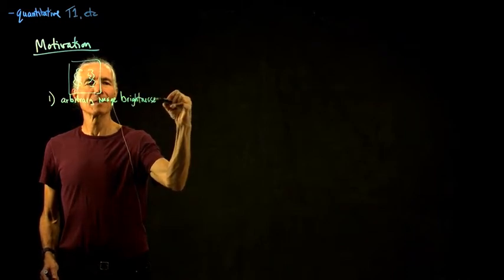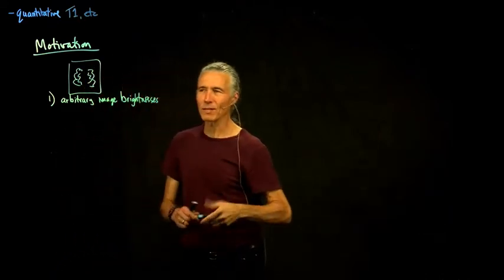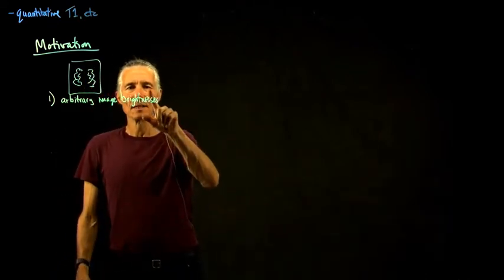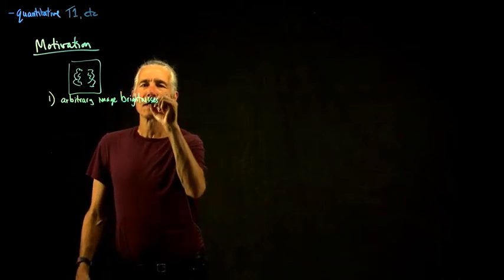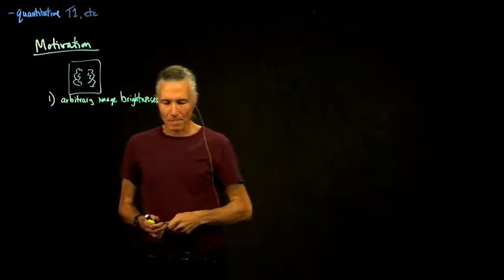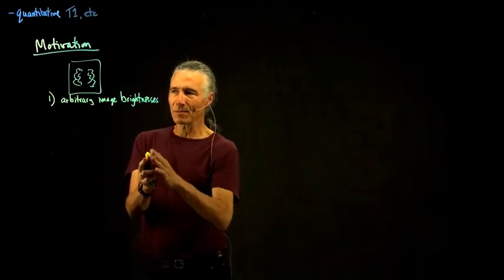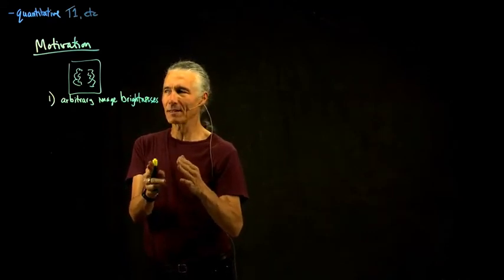And obviously, there are significant differences between those, like the gray and the white matter have different numbers, but there's no way that you can say that, because it was 400 in this guy and I scan somebody else and it's 500, there's actually a difference.